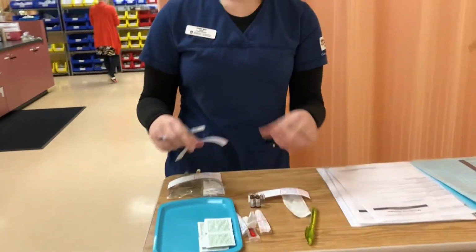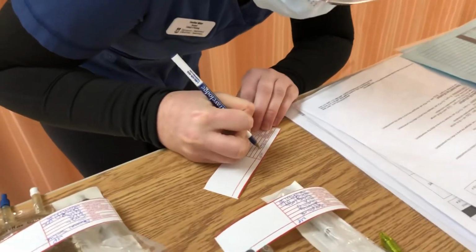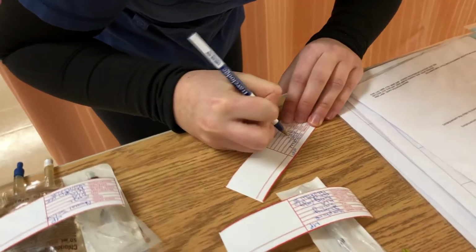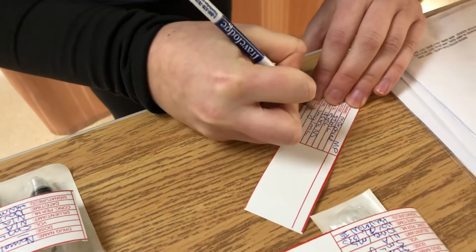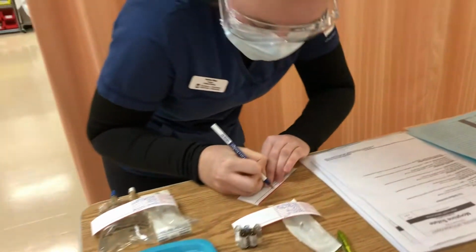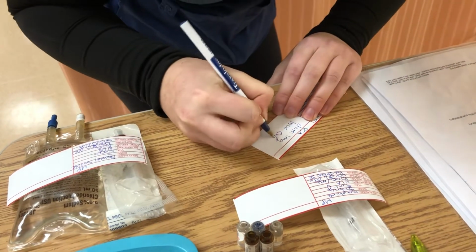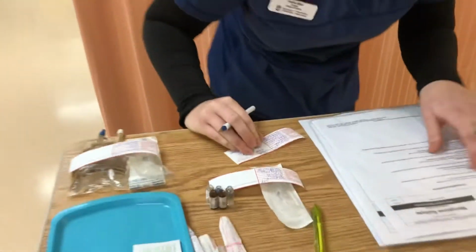And lastly, I'm going to create a medication label for the mini bag for after I inject the medication. So this is for Marcy Paris. This is morphine. The dose in the bag is going to be 50 milligrams. And the volume of the medication is 5 milliliters. The diluent is 45 milliliters of normal saline for a concentration of 1 milligram per milliliter. It is November 20th at 13:30, and I'm Heather Milan, University of Manitoba student nurse 3. This is to be given PCA with a dose of 1 milligram and a lockout of 5 minutes and a final bag volume of 50 milliliters. So here I have 50 milliliters, so that's good to go.